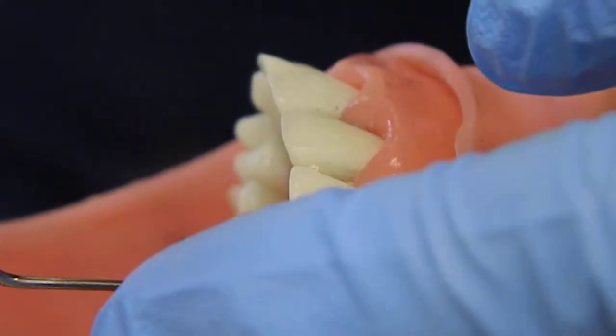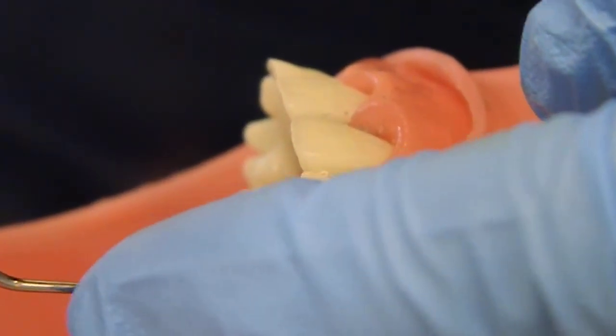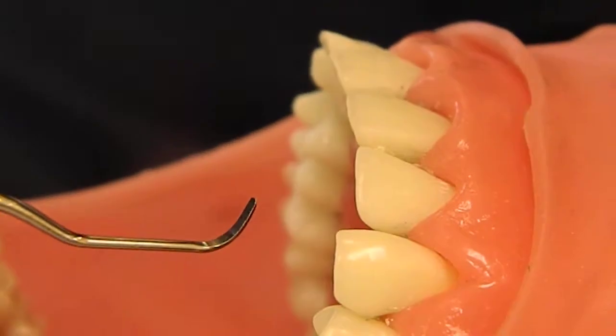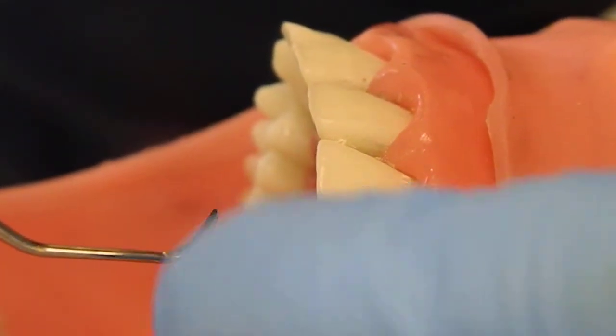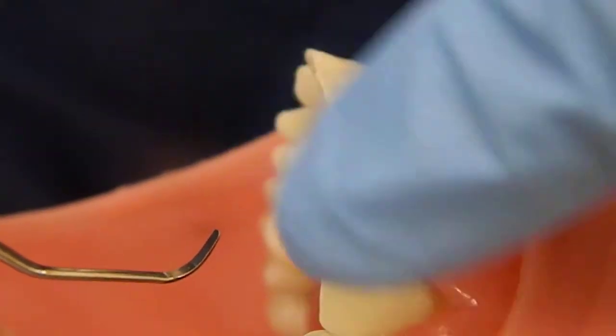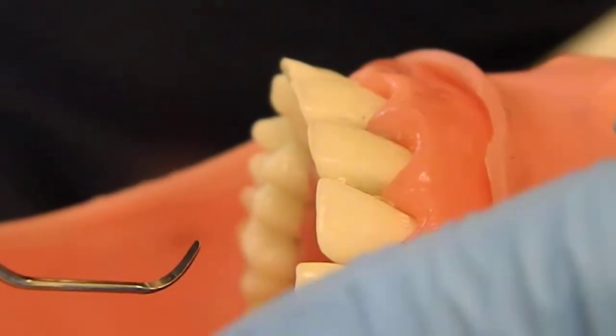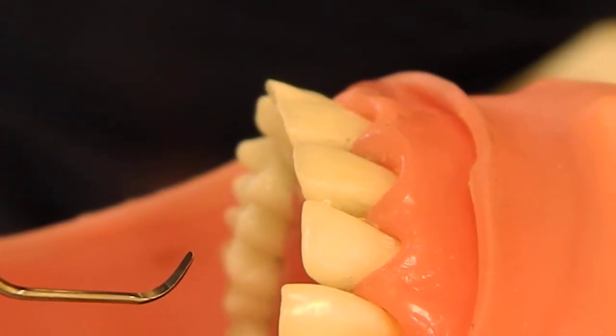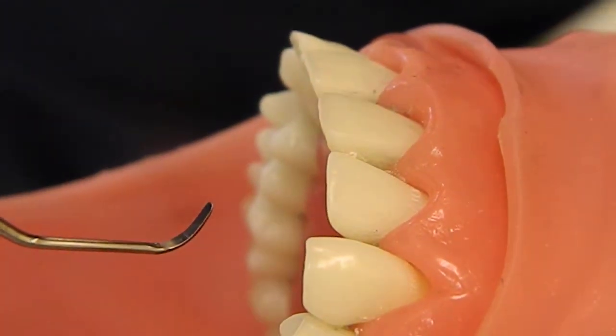Looking at the instrument, as we know, the Graceys have a tilt to the blade already at a 70-degree angle, so one part of the blade is going to be lower than the other. You can see that the blade is tipping this way — this is the lower blade, and this is the higher blade. The lower blade is the cutting edge and should be applied to the tooth.